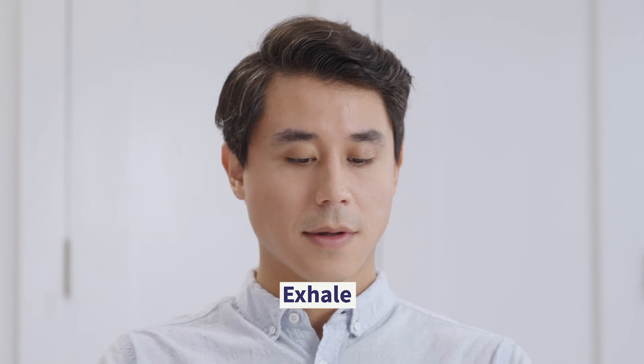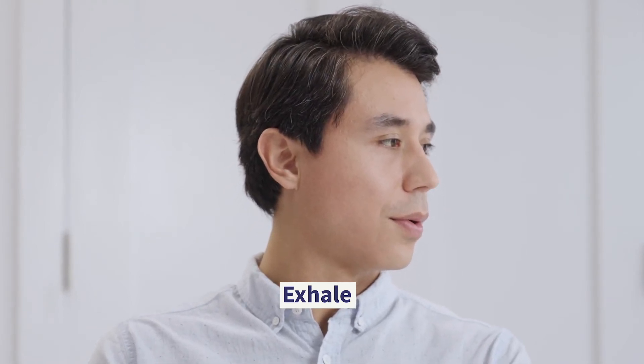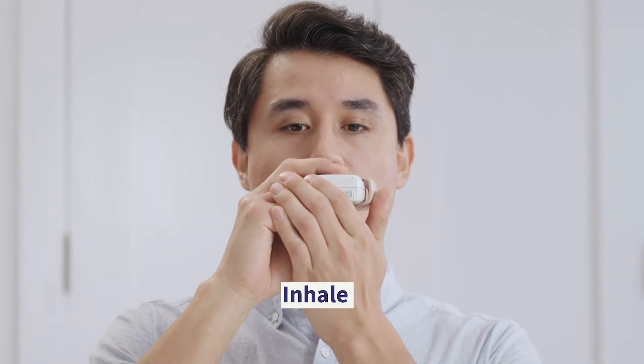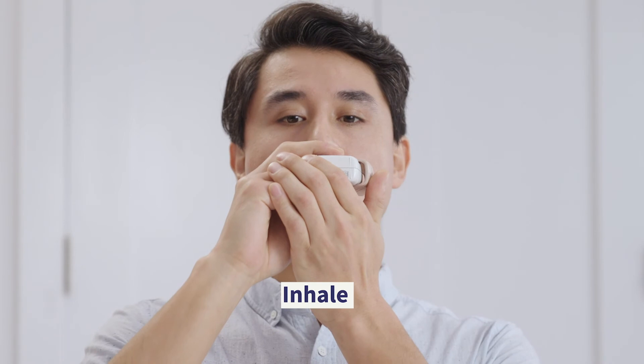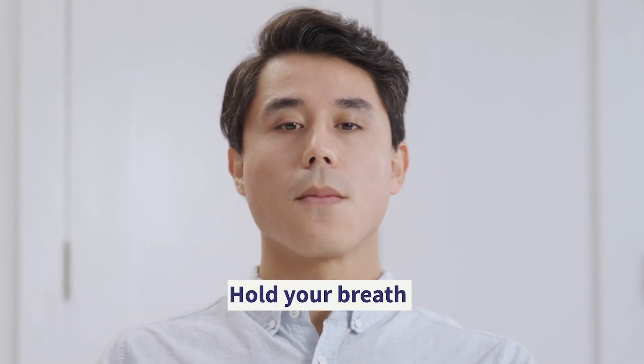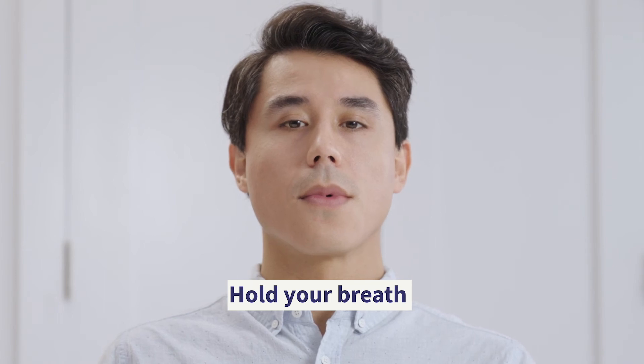Next, exhale completely through your mouth, pointing away from the Ellipta. Place the mouthpiece between your lips and close your lips firmly around the curved shape of the mouthpiece. Make sure not to block the air vents with your fingers. Then inhale a long, steady, deep breath through your mouth. Don't breathe in through your nose. Take the Ellipta out of your mouth and hold your breath for three to four seconds to make sure that the medicine gets deep into your lungs.